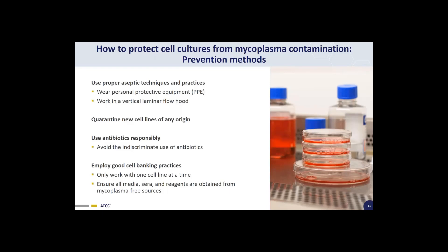To both avoid and control the spread of mycoplasma contamination during cell culture, we recommend the following laboratory practices: use proper aseptic techniques, wear personal protective equipment (PPE), and work in a vertical laminar flow hood. Always quarantine any new cell lines. If you're going to use antibiotics, use them responsibly — avoid indiscriminate use, as you can generate antibiotic-resistant bacteria within your culture. It's also important to employ good cell banking practices: only work with one cell lot at a time, and ensure that all media, sera, and reagents are obtained from mycoplasma-free sources.